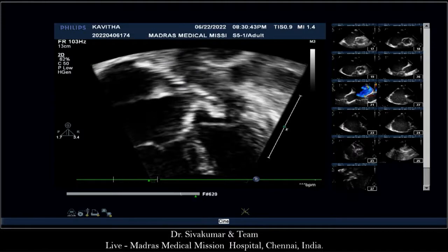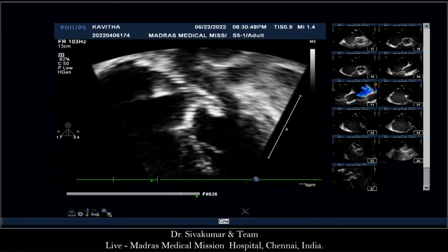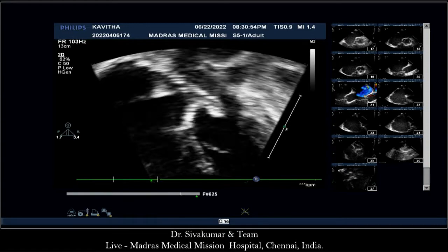So when the patient is awake, his blood pressure will be higher. It will be a totally different dynamic. The angulation is such that it's pointing towards the left atrium quite a bit. Yeah. But it may not change because the device is so big.